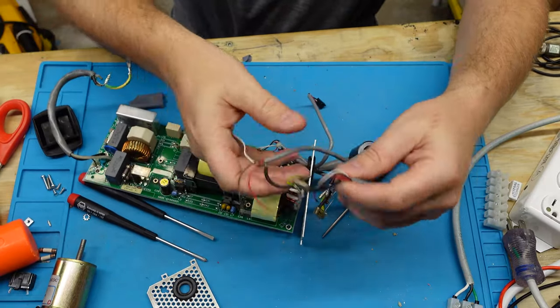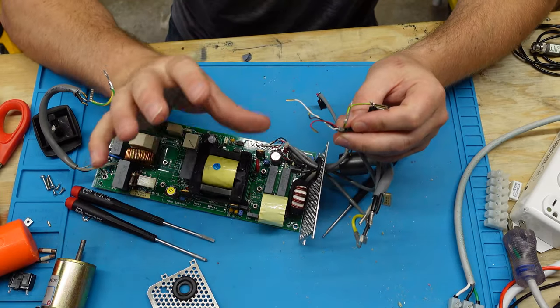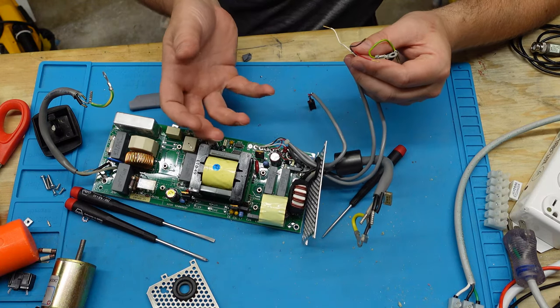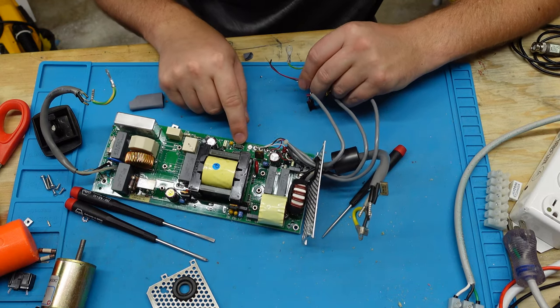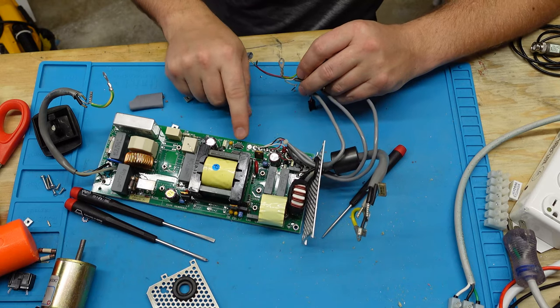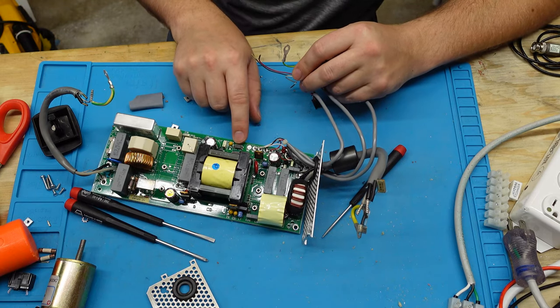So the way the output side of this works is these wires right here go to your potentiometer that's on the front of the device. And your potentiometer basically adjusts your feedback loop, saying, hey, give me more power, give me less power, based on the resistance. And I don't know if they directly are adjusting the voltage that's seen right here on your opto-isolators. It'd be interesting if that's the way that they did it, because as you increase the resistance of the potentiometer, you would decrease the LED that's inside your opto-isolator.